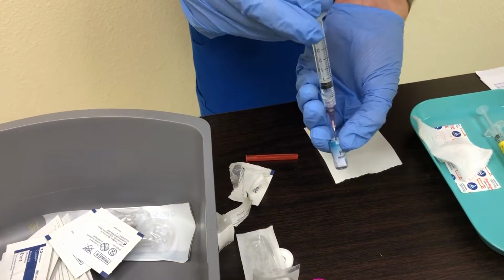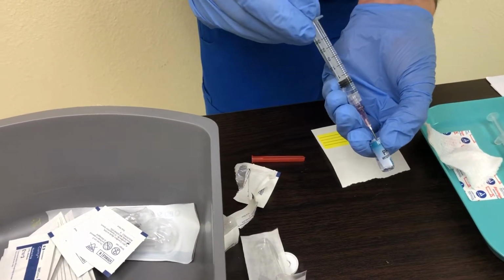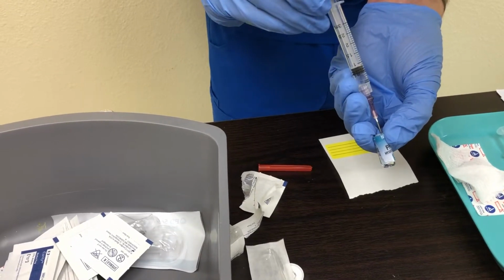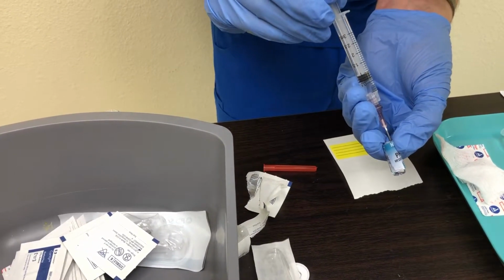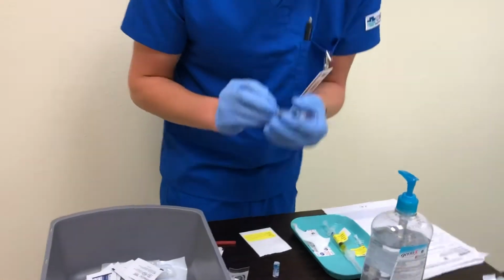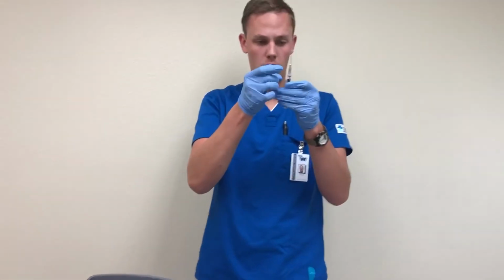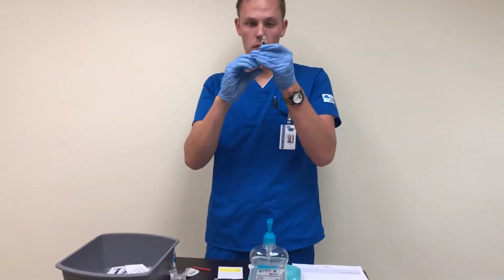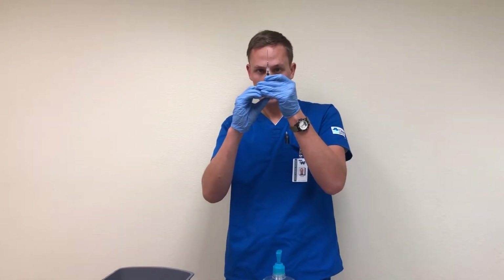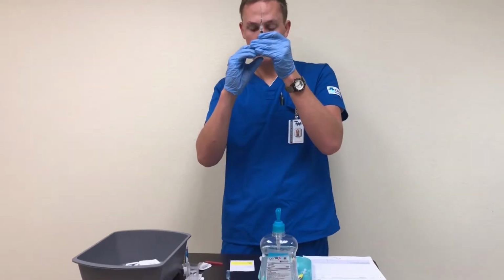Okay, and I do have a little bit of an air bubble in there, so I'm just going to make sure to pull out a little extra. Okay. And then when I pull it out, I'm just going to get that air bubble out of there, make sure I got the correct medication in there. And there goes the air bubble. And we're right at 0.5.